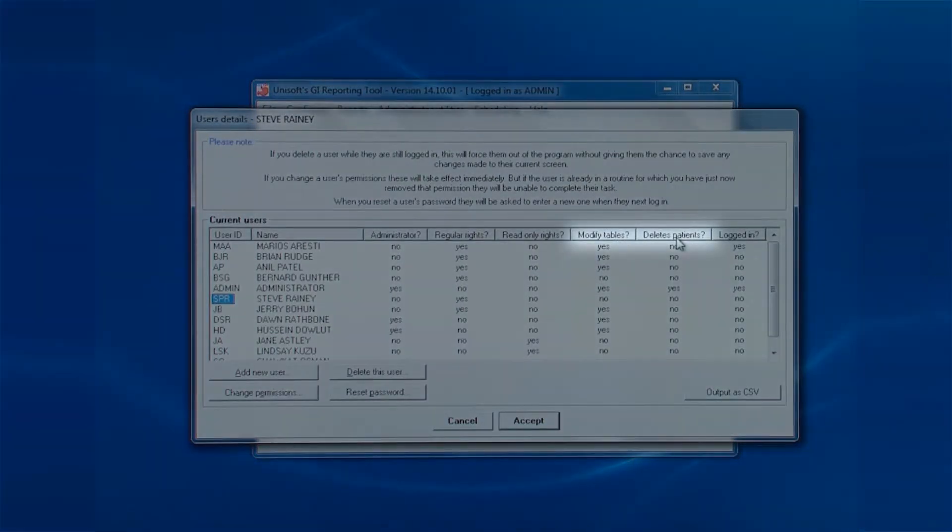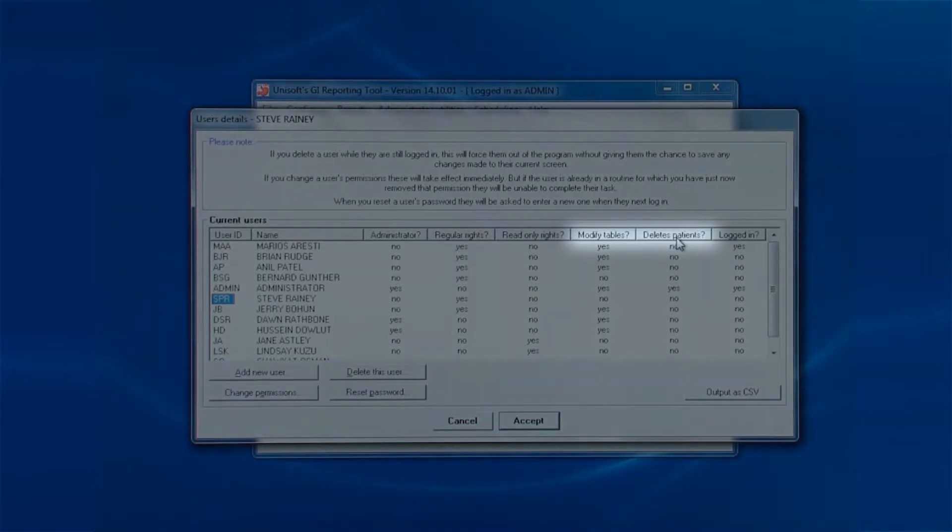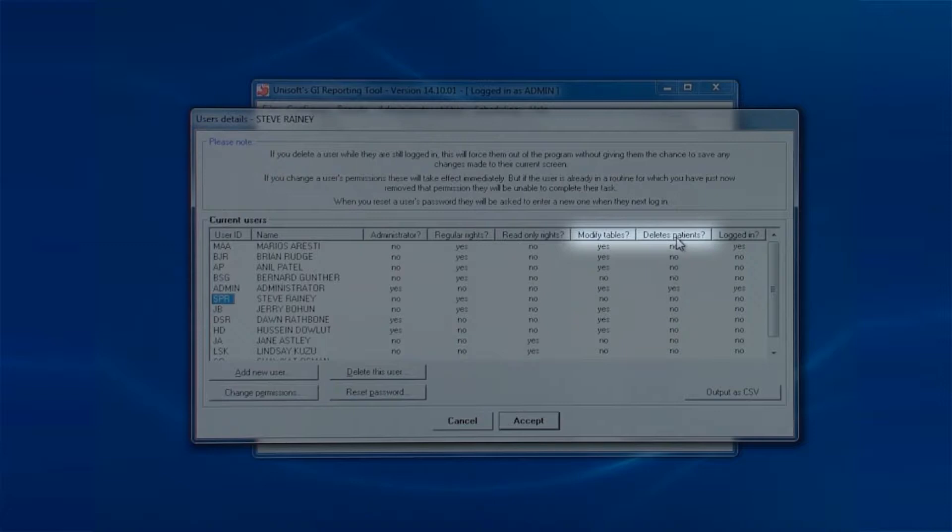Note that there are two further columns: modify tables and delete patients. The first is for those users allowed to add text to the drop-down boxes found throughout the software. If that is a no, the user will only be able to pick entries from the drop-down list. They won't be able to add anything.